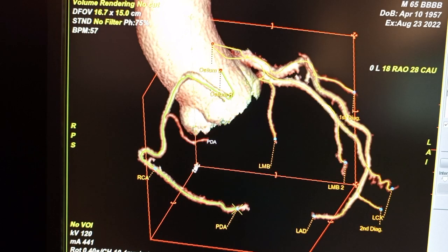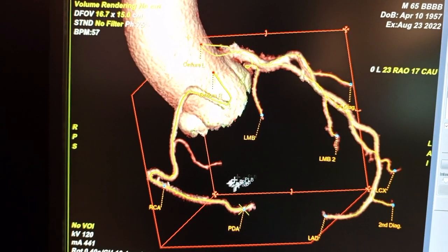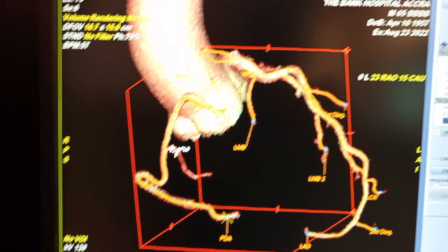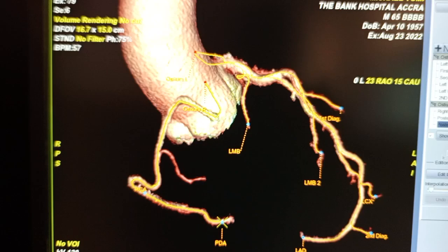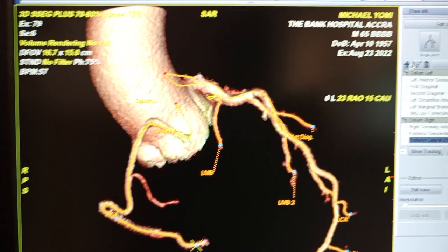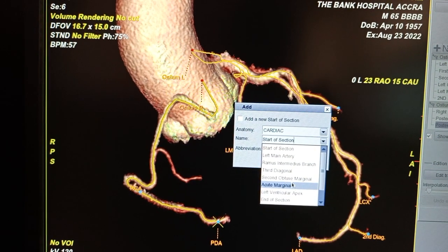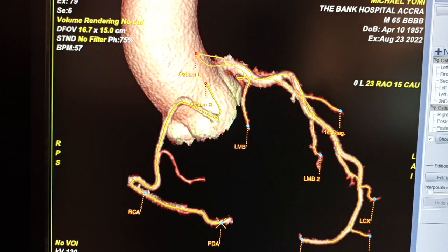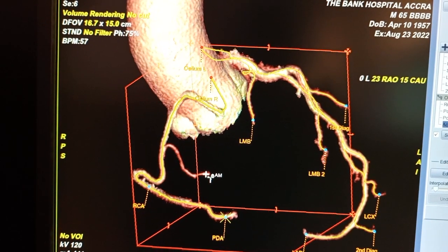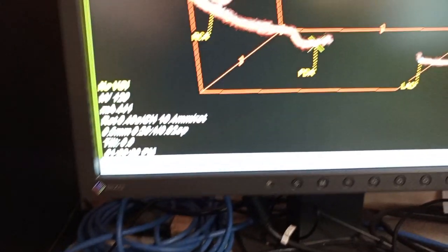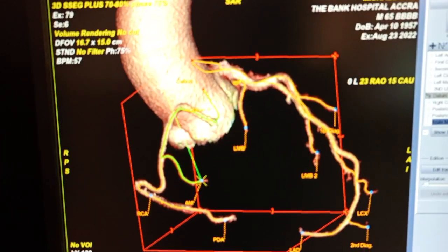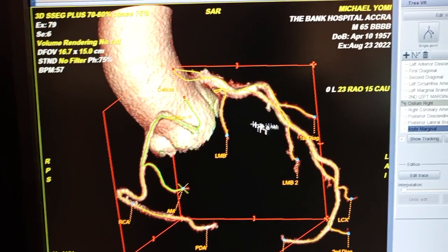The reason we are doing this is because we are performing vessel analysis and each vessel has to be tracked. We have the posterior lateral branch — it's not here, but we have the acute marginal branch. We go and add the acute marginal. If there's no acute marginal, you can just add and continue. Make sure all the vessels are complete and every vessel is tracked, then go to Next.